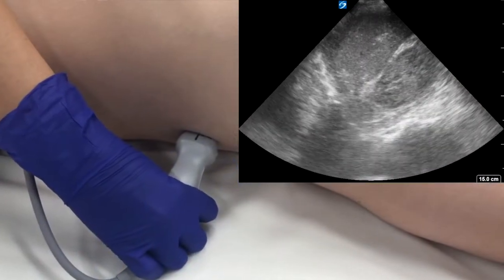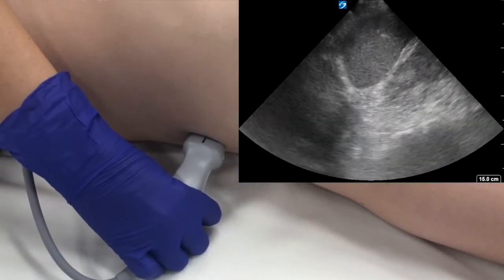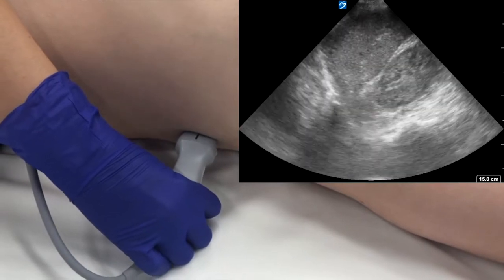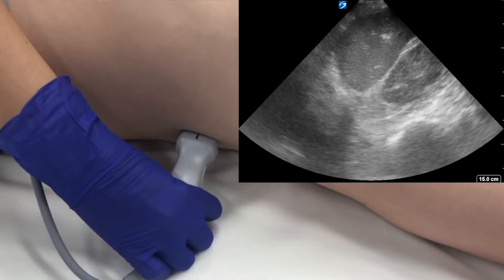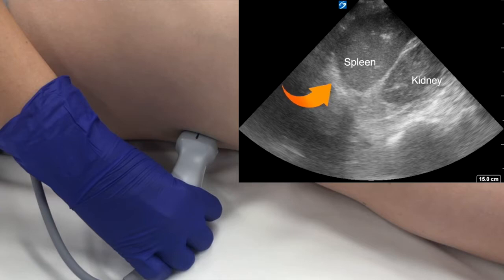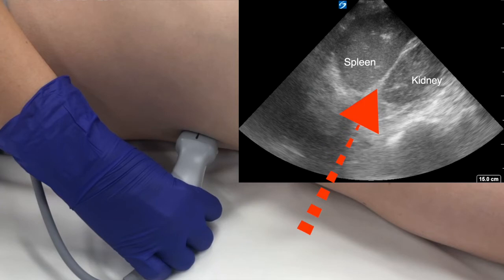The left upper quadrant is viewed with a similar technique. The probe is placed more posterior along the left costophrenic margin, oriented vertically with the probe marker pointed superior. The examiner should view the diaphragm, the spleen, and the left kidney. Again, the diaphragm appears as a bright stripe that should interface directly against the spleen. The area between the spleen and the left kidney often has a gray fatty interface. Any dark space between these structures is evidence of blood.